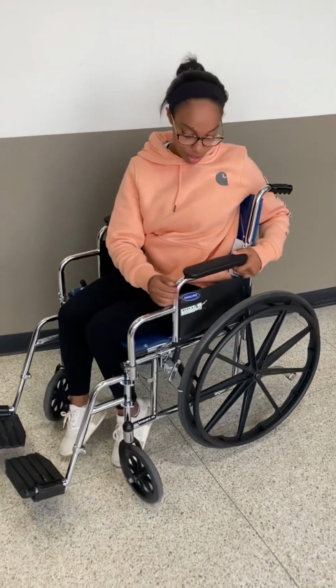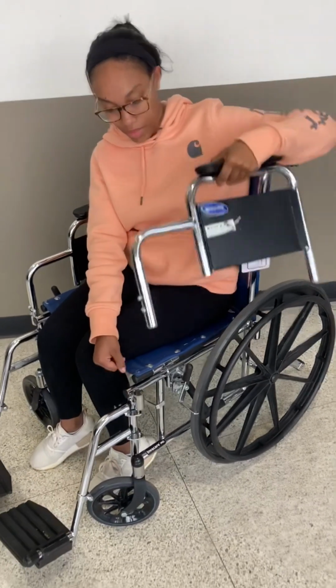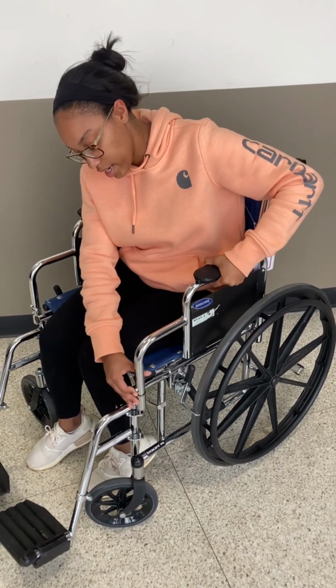And then your armrest, there's a button right here. You're gonna push the button and just go up. That's how you detach them. To reattach them, you line them up with the holes and you push the button to go back down. That's how you reattach them.